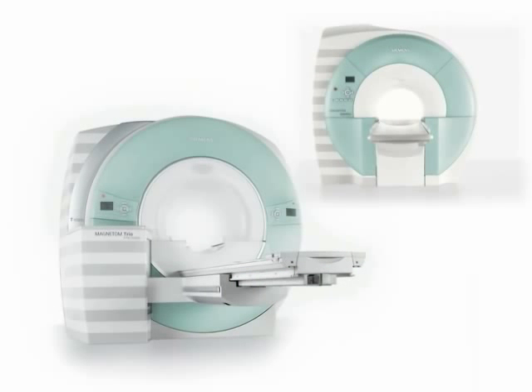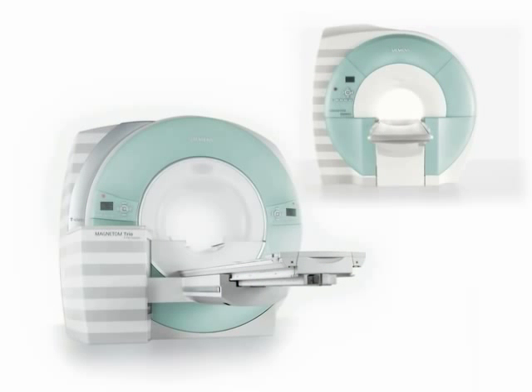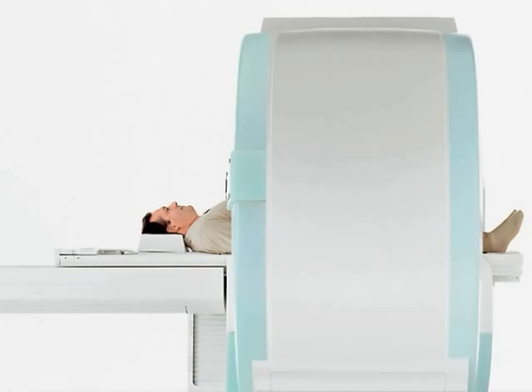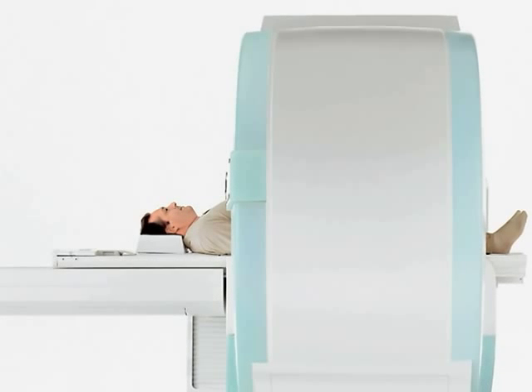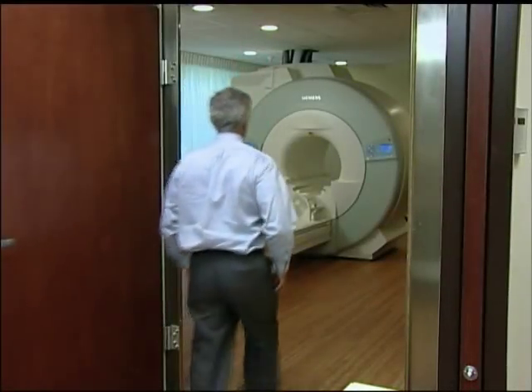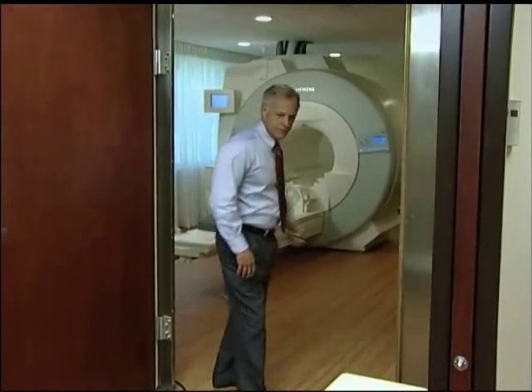You will be introduced to different magnets and learn the effect of those various magnets. Examples will be used to demonstrate the strength of the magnetic field and the dangers faced when handling magnetic objects in the examination room.